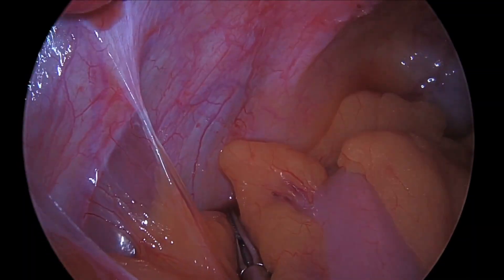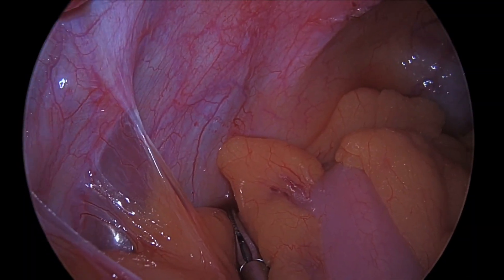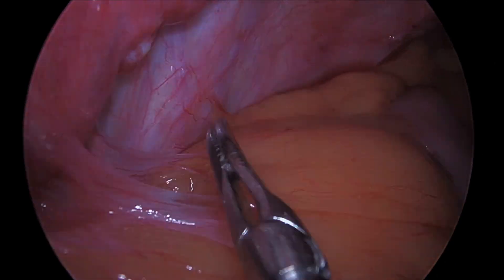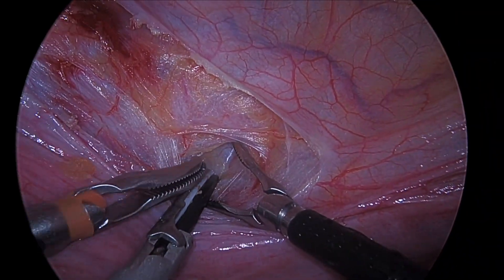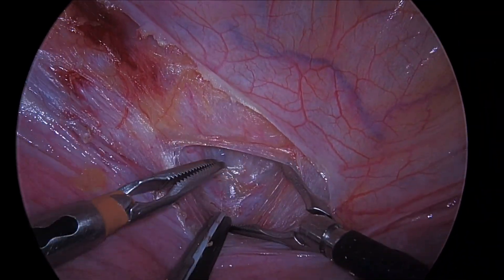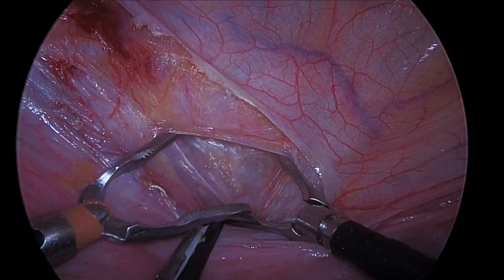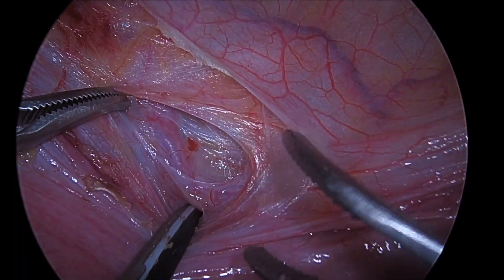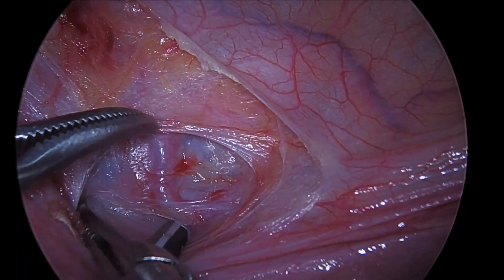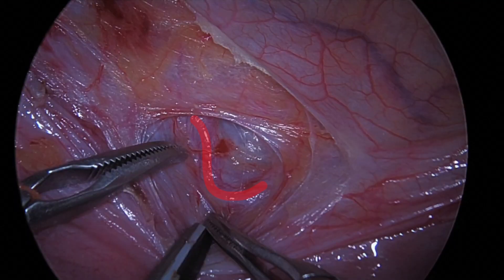Ureters are identified to confirm their location is away from the cervico-isthmic junction and lateral to the window. Similarly, a window is created on the contralateral side. Interestingly, the uterine artery on this side is found more cephalad than would be expected, emphasizing the importance of window creation and planning suture placement.